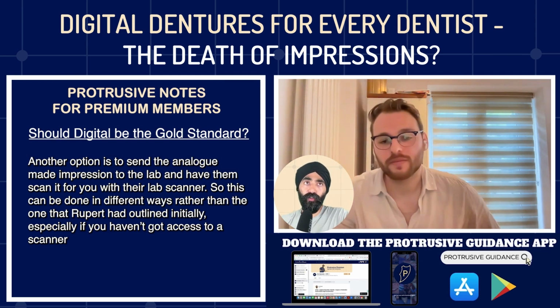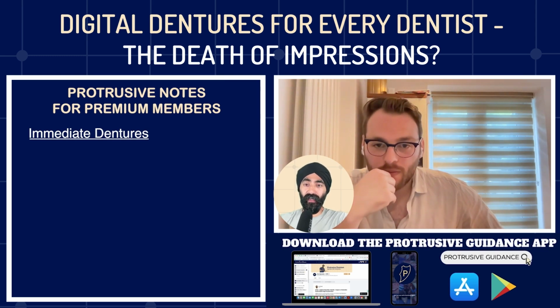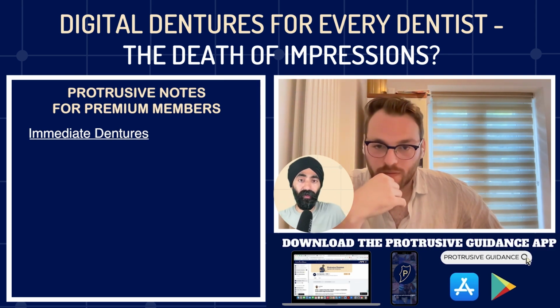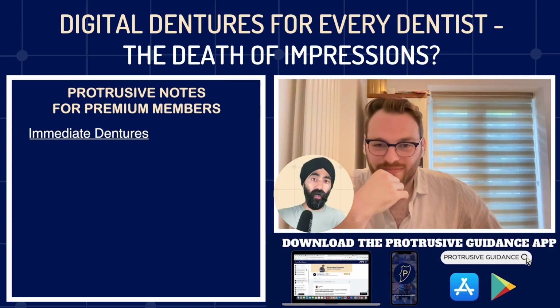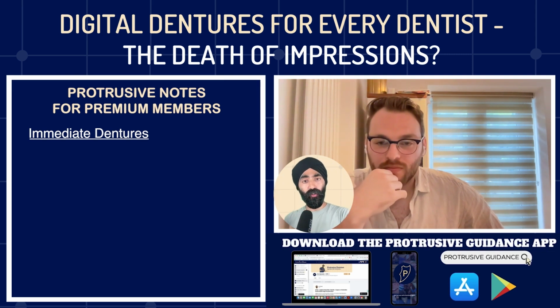Yeah. So on this topic of immediate dentures you just mentioned, is a really easy win for someone who's never done anything, who is really new to digital, to scan? Imagine you're doing an immediate denture to replace 2 upper laterals or something, right? Upper left lateral, upper right lateral, and then they've got these dodgy restorations in there, they're about to be extracted. If you scan the arch as standard, you've got enough teeth to get your retention, the acrylic can actually engage into the undercuts. Is that a really easy, impression-free win for immediate dentures, or am I missing something here in terms of some nuances that we should consider before scanning over impressions?